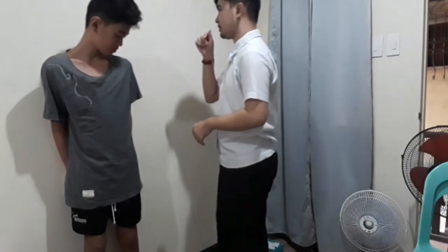The nutritional assessment. So first we'll take the anthropometric measurement of the patient. First we'll take the height of the patient. Okay, so the patient's height is 163 centimeters. So now we'll take the patient's weight.